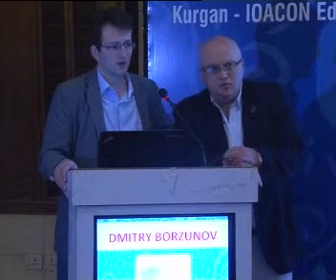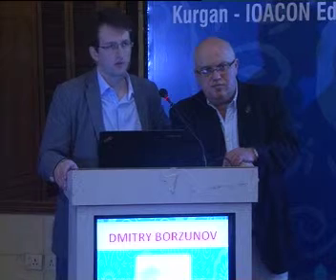So metaphysis is the best site for elongation. So you can be faster in metaphysis. But if you are working on the diaphysis, it's a big challenge, and you must control it very, very exactly. If you make some mistakes in the diaphysis, the risk of complications is very high.